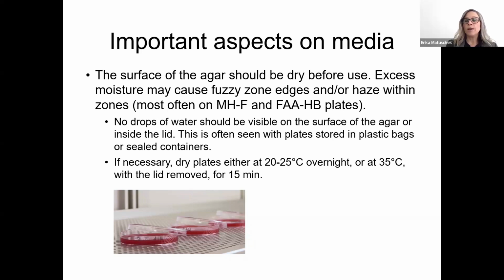It's more common with excess humidity in plates that are packed in plastic bags. And you can dry plates either at 20 to 25 degrees overnight or in the incubator at 35 degrees with the lid removed for 15 minutes.